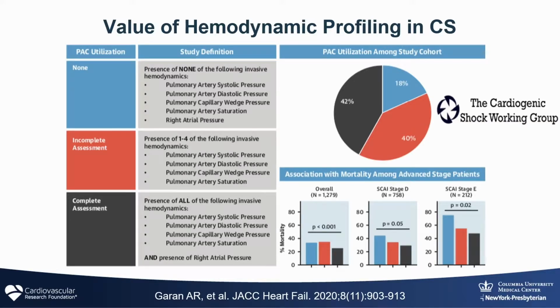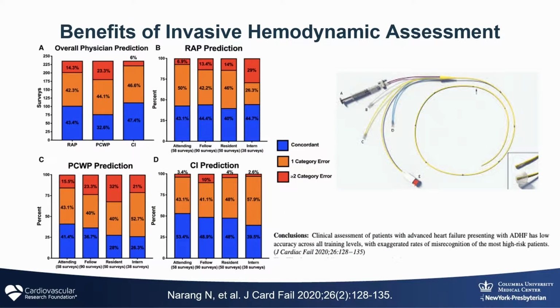I'm not going to go through much of these data other than to say that in the sickest patients, when you see a therapy that's invasive starting to demonstrate a benefit in observational data, that's actually a pretty powerful sign, because usually speaking, if you take sick people and you study the use of MCS in them or other things, you're always going to show worse outcomes because the patients were just more sick. So if you take an invasive intervention in a sick patient population like those in shock and show a benefit, there is probably a benefit there that needs to be determined in randomized trials.